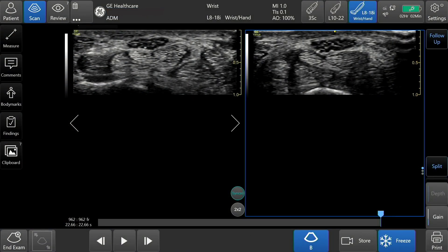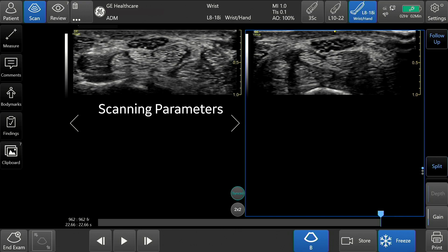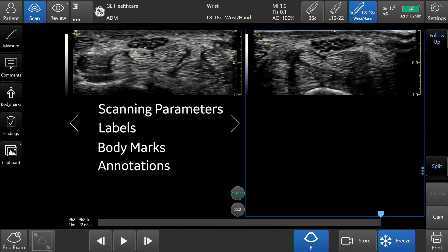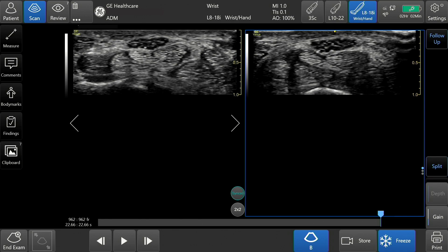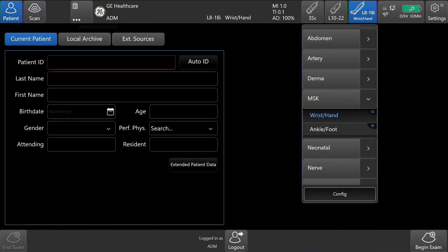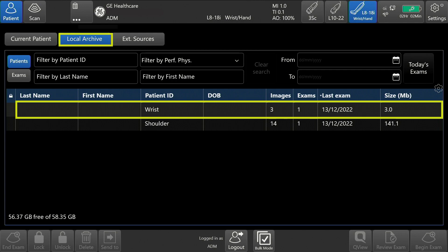The follow-up tool allows the user to scan a patient while viewing images from a previous exam at the same time with a side-by-side comparison. The user may select a previously stored image to appear on one side of the screen. The system will then automatically restore the scanning parameters, labels, body marks, and annotations from the selected stored image and apply them to the live image. Follow-up scanning allows the user to use consistent scanning parameters from exam to exam on the same patient for image comparison, which may assist in assessing a patient's condition over time. From the patient page, select Local Archive. Tap the patient exam that you will perform a follow-up study on.